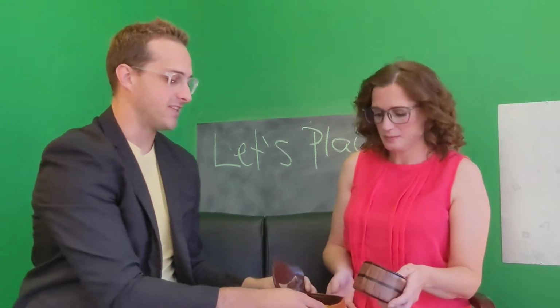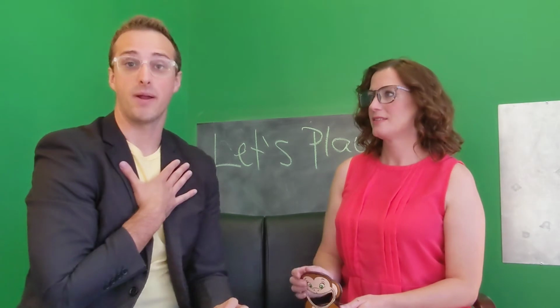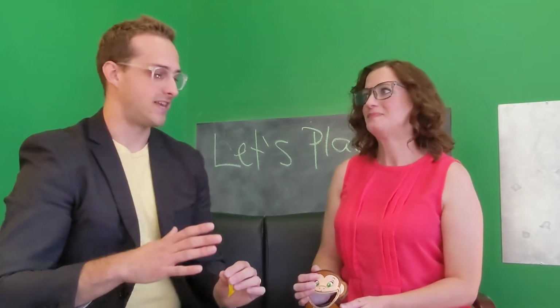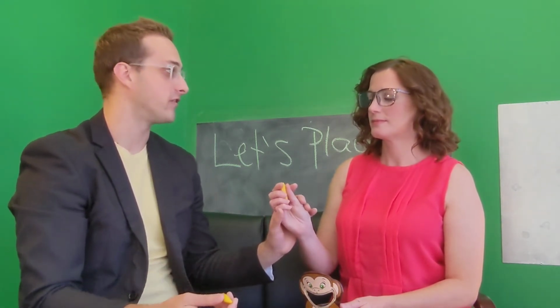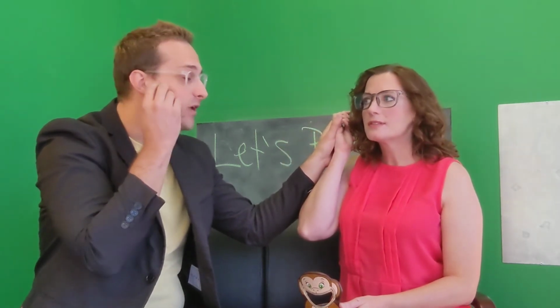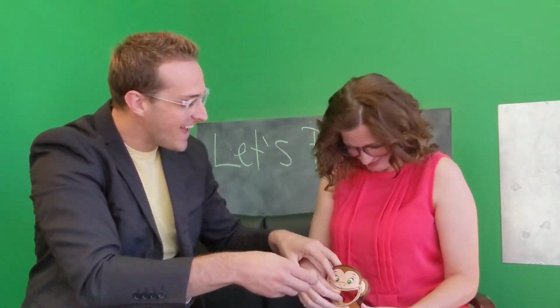And so what that can look like, I'm going to have Lindsay be the patient this time. And if you're a parent, this is for you, just because a lot of times, especially in my practice, I use the parents a lot for this to help keep things going. So sometimes kiddos might misunderstand the instructions, and so it can help to do what we call hand over hand, which is where I help hold it up to the ear, and I hold mine up to mine as well, and we listen. Beep, beep, beep, beep, beep. Did you hear that? There you go, okay, so now we're going to put it inside there.